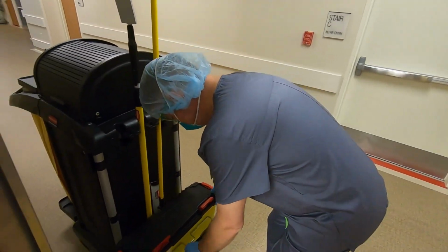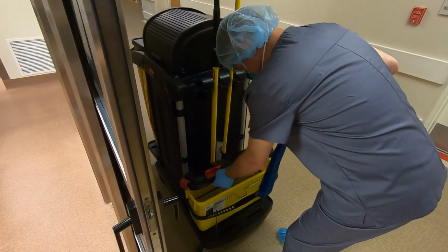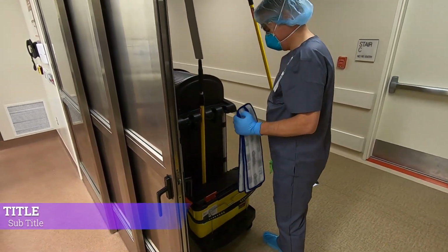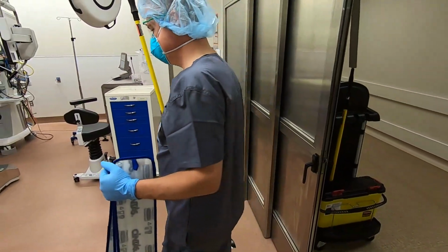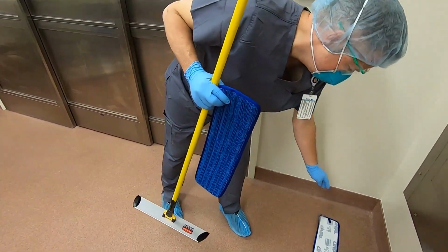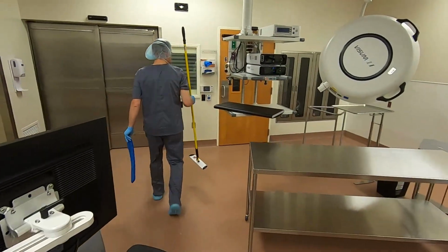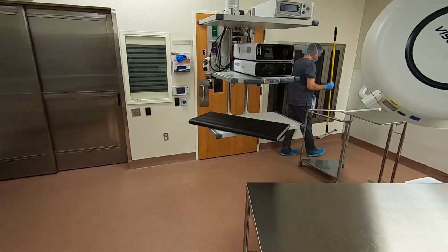Next, we will perform perimeter floor cleaning and disinfection. Collect the microfiber mop and handle from the cart. Obtain 2 blue disinfectant cleaner charged microfiber wet mops. These will be placed around the room in front of the wall opposite the door based on the clockwise or counterclockwise path you will be following through the room. Place the other microfiber mop at the far end of the room that you will use when you reach your halfway point.